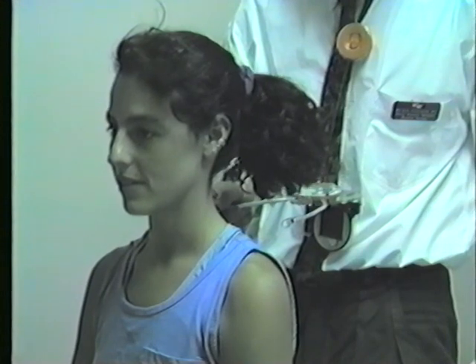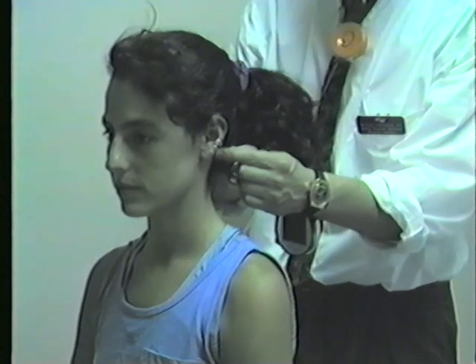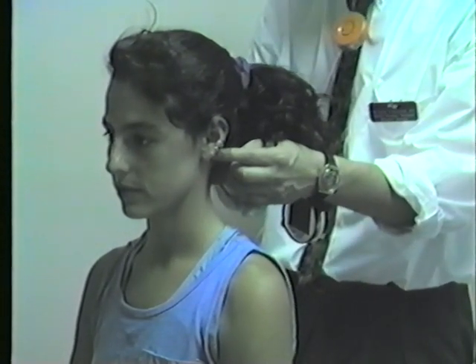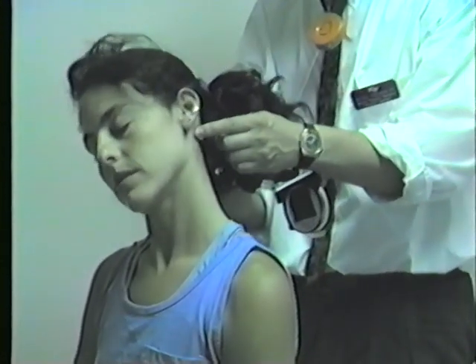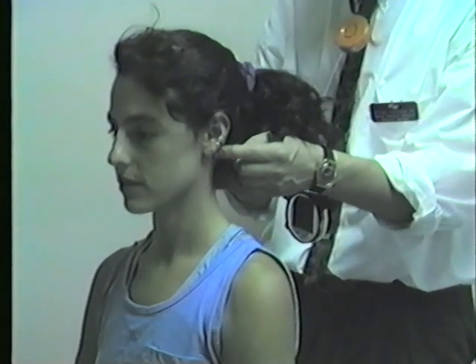I can also measure cervical side bending by palpating the mastoid processes. And now if Cheryl bends towards the left side and towards the right side, I can read the inclinations between the two points on the inclinometer.